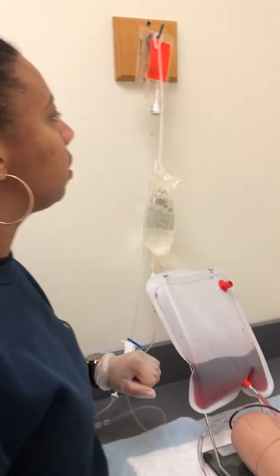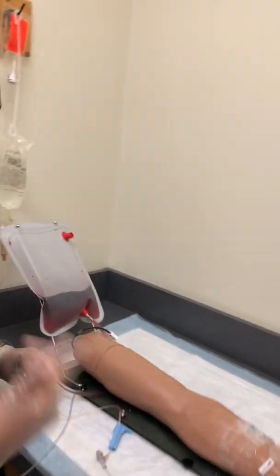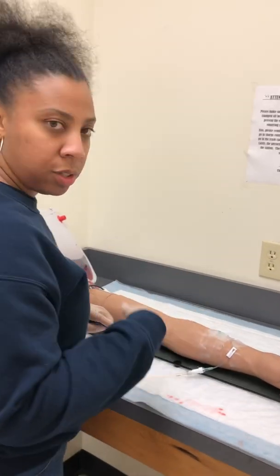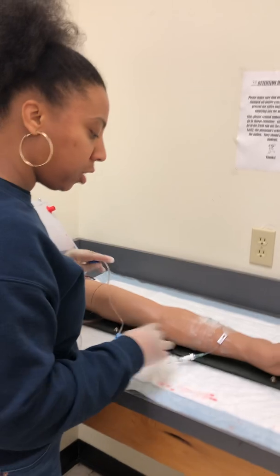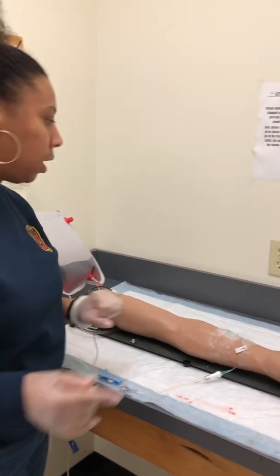All right, so while the medication is going, I will still look for signs of infiltration. Make sure there's no redness or tenderness. Ask the patient how they feel while the medication is going. I would get my MAR and I would document.